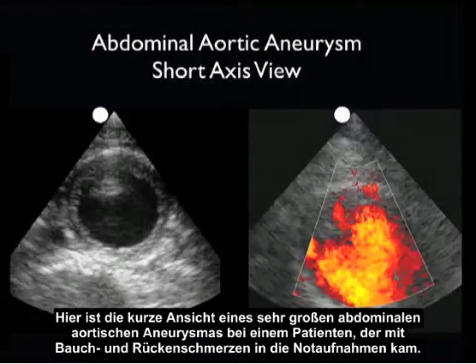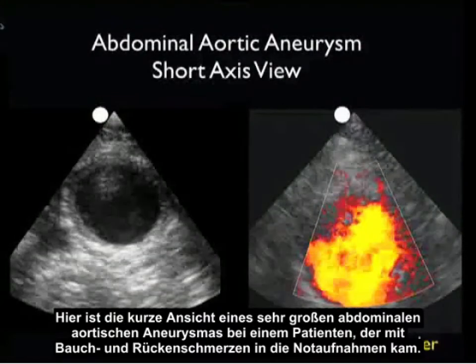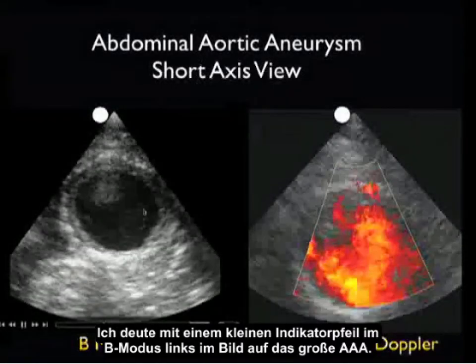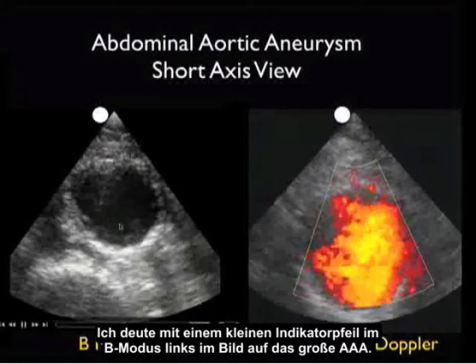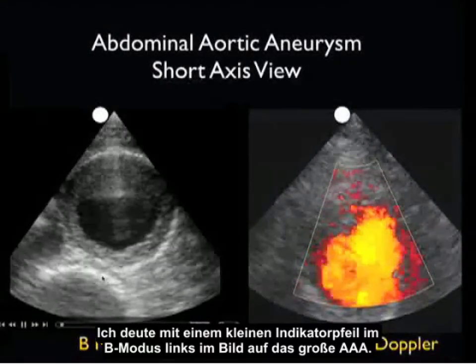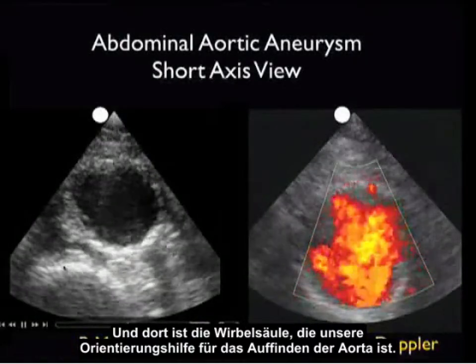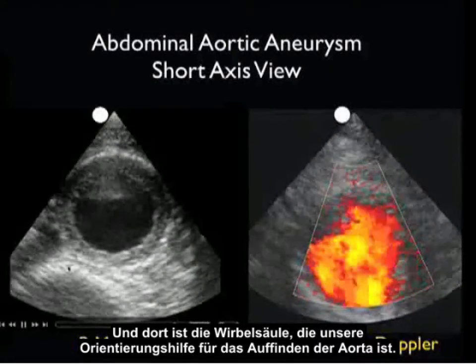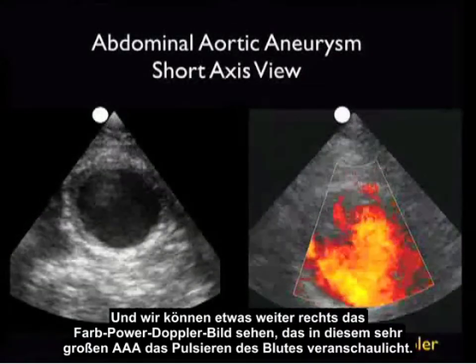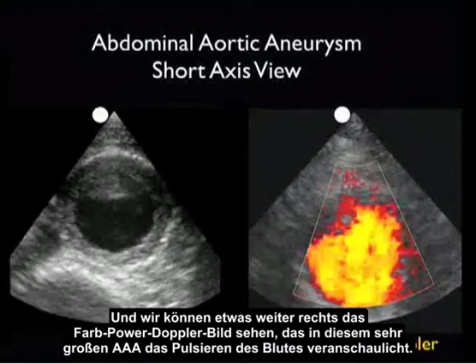Here's a short axis view of a very large abdominal aortic aneurysm in a patient who presented to the emergency department with abdominal and back pain. With a small indicator arrow, I'm showing in the B-mode image towards the left the large AAA, and there's the spine, which is our landmark for determination of the aorta. We can see the color power Doppler image towards the right showing pulsations of blood within this very large AAA.